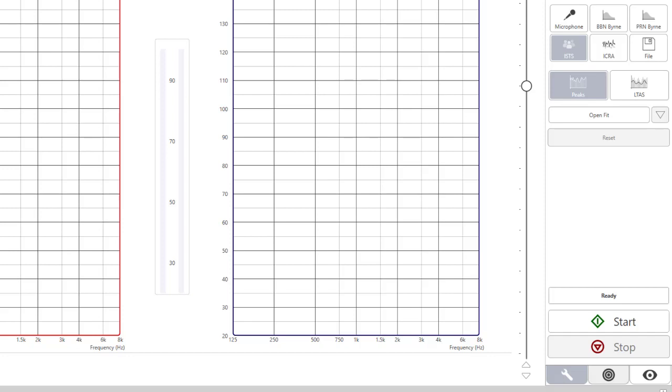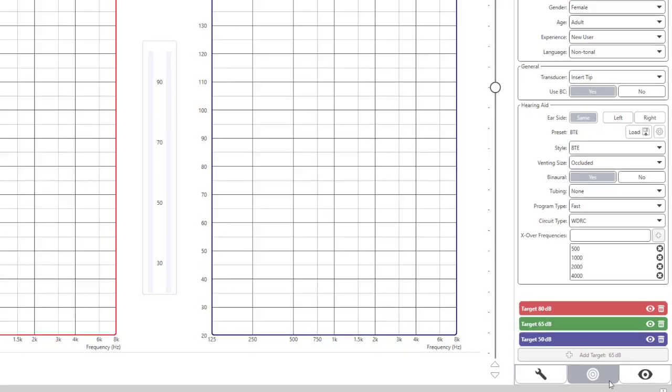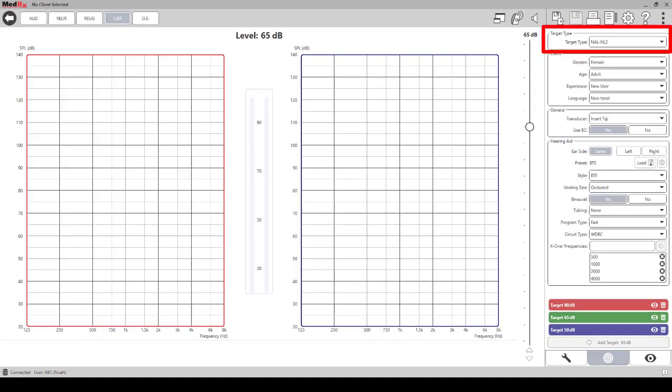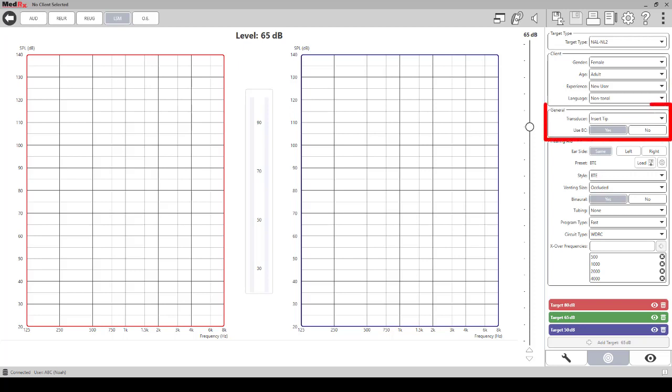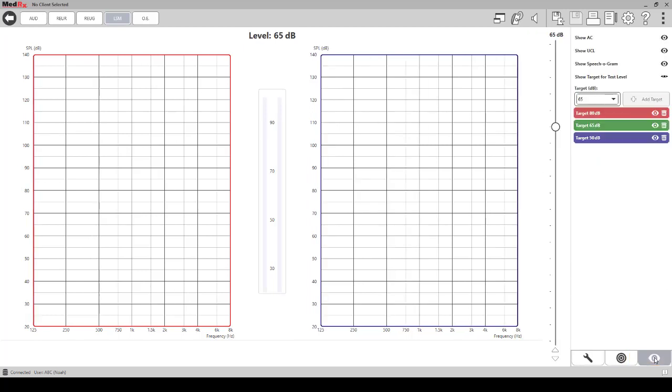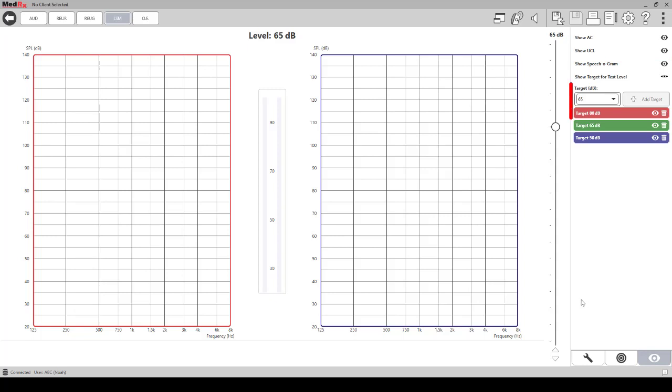At the bottom right corner of the screen, please click the target icon. Use this screen to select or change your target type, input, client transducer used, and hearing aid info, and to display or hide target curves while testing. Click the plus icon to add target levels. Click on the view icon to hide AC and or UCL targets during the session. You can also change, hide, or add target levels in this screen.